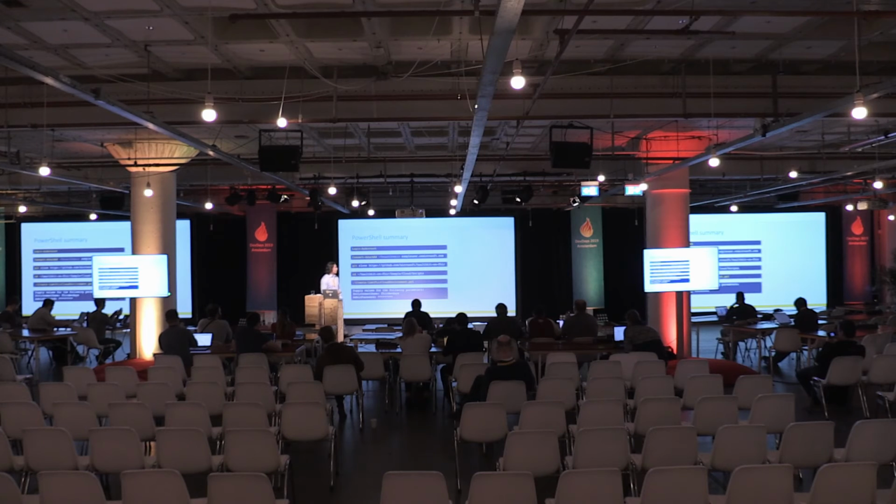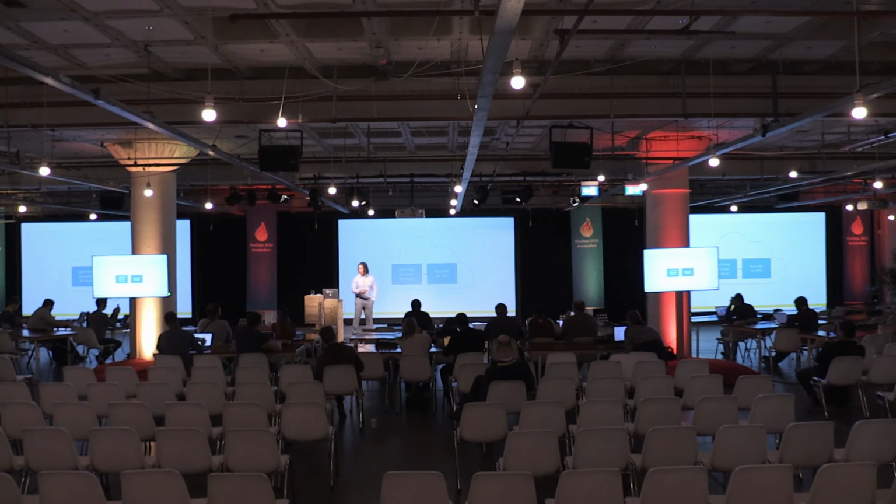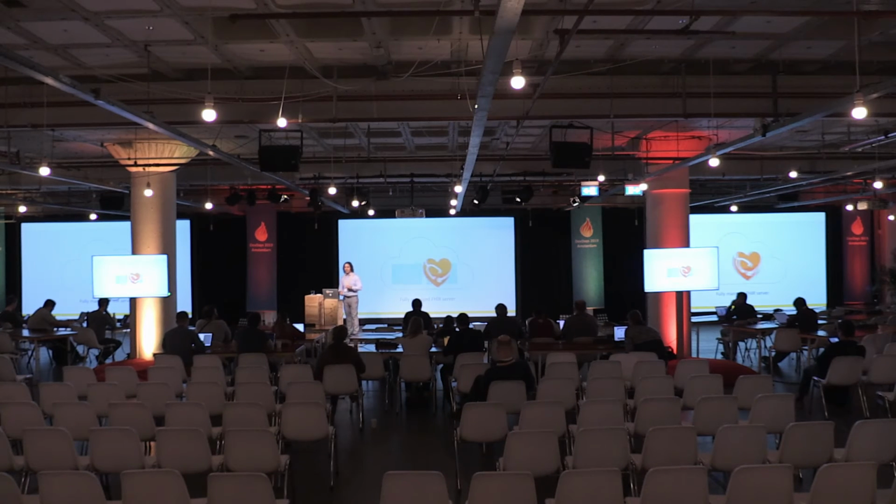Okay, so what is this PowerShell script doing? So number one, it's doing a bunch of things, but I'm going to talk about two things specifically. So number one is deploying the Azure API for FHIR, which is Microsoft's fully managed FHIR server. And then the other thing it's doing is it's deploying the IoMT FHIR connector for Azure. So this is the pipeline that Dustin talked about in the previous session. It's an IoMT data pipeline that sets up an endpoint where you send IoMT data to it. It groups data appropriately, and then it stores it into FHIR resources.